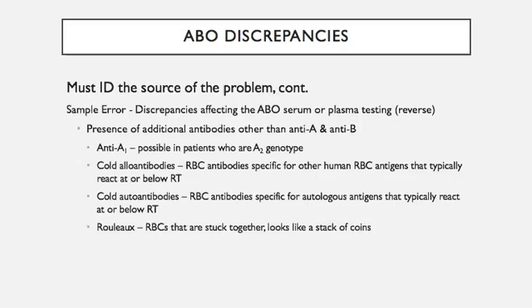Or have you got missing or weak ABO antibody reactions? It could be due to the patient's age. Either they've not formed antibodies yet, in the case of very young patients, or they could have a lower concentration of antibodies in older patients. Diagnosis: reduced antibody levels are associated with different pathological states, such as agammaglobulinemia, which is absence of the gamma globulins and antibodies in the blood, due to leukemia, myeloma, or lymphoma. And has the patient been on any type of immunosuppressive therapy for transplantation?